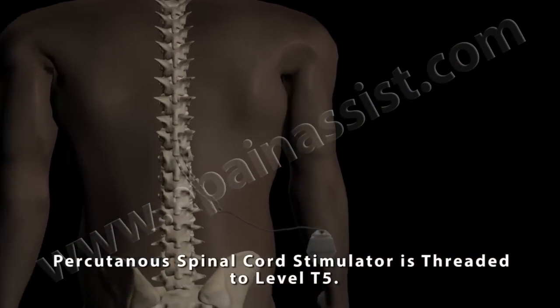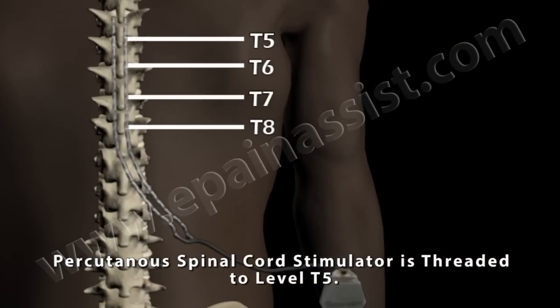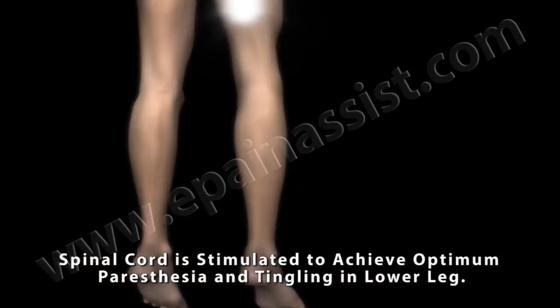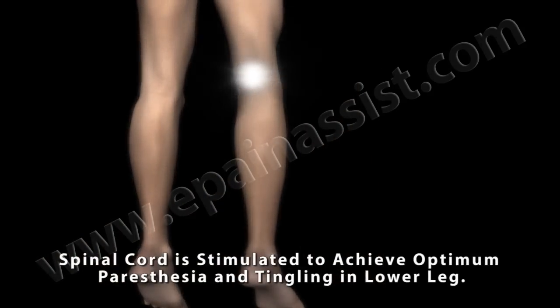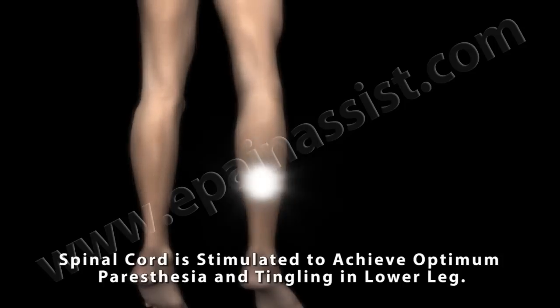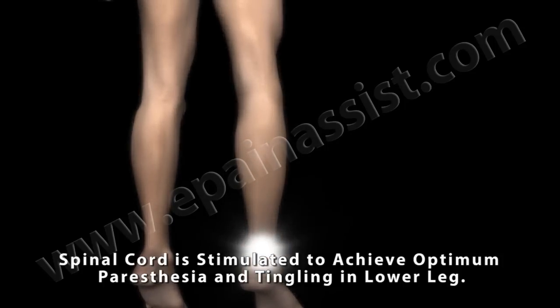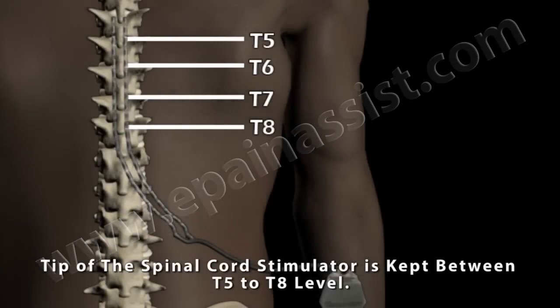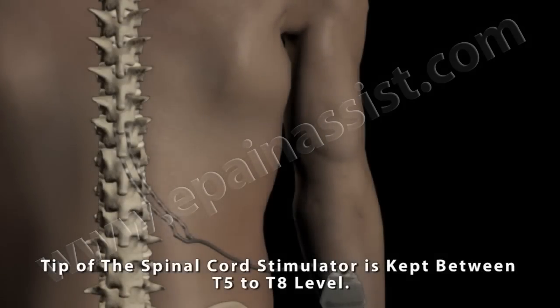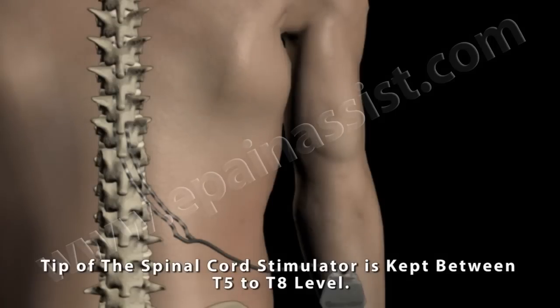The percutaneous spinal cord stimulator is threaded to the level of T5. The spinal cord is stimulated to achieve optimum paresthesia and tingling in the lower leg. The tip of the spinal cord stimulator is kept between the T5 to T8 level.